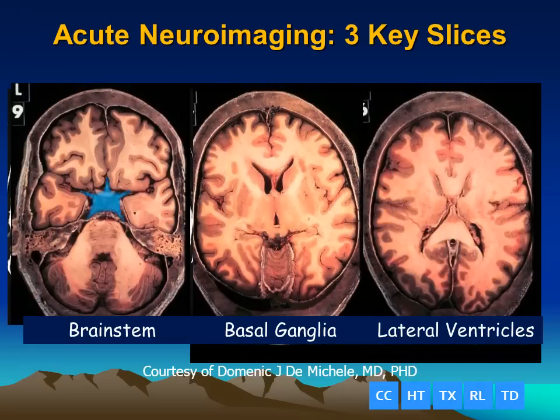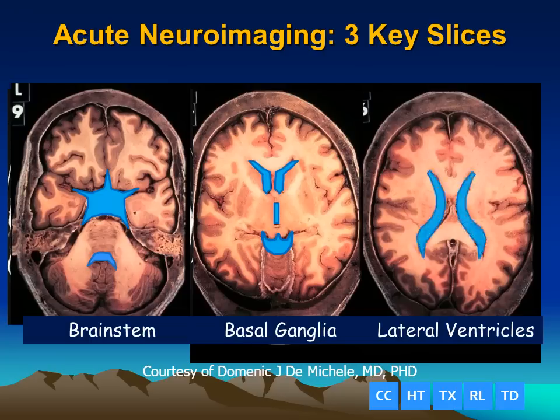If we look at the normal brain slices, we can see the suprasellar cistern filled with cerebrospinal fluid, and the fourth ventricle. At the level of the basal ganglia, we have the two frontal horns, the third ventricle, and the quadrigeminal plate cistern.